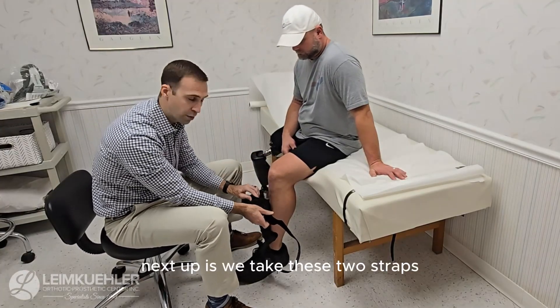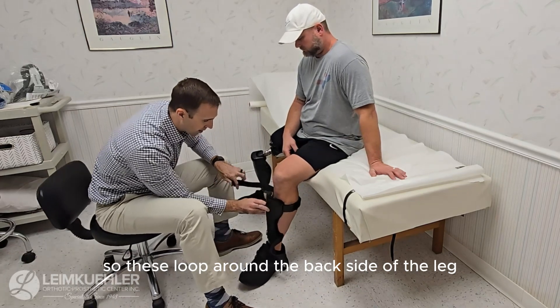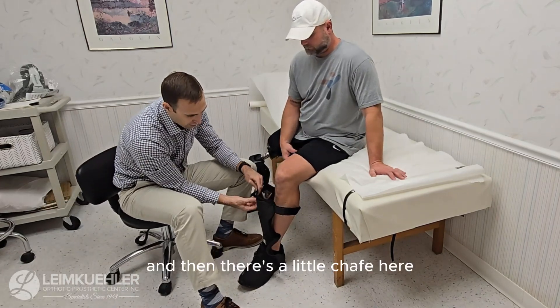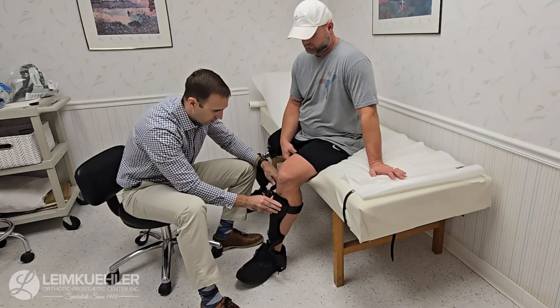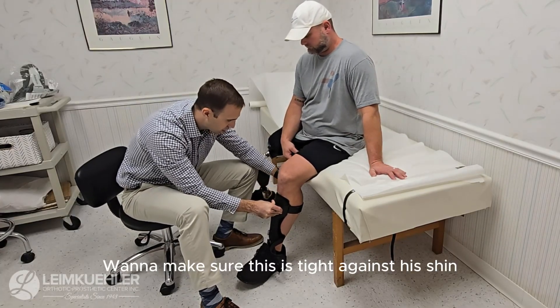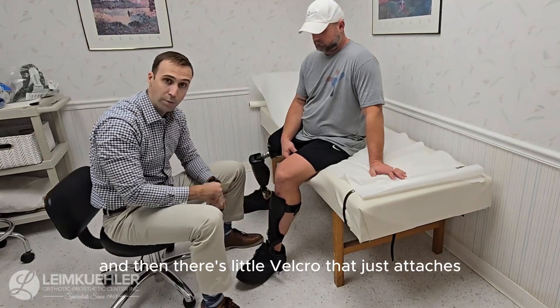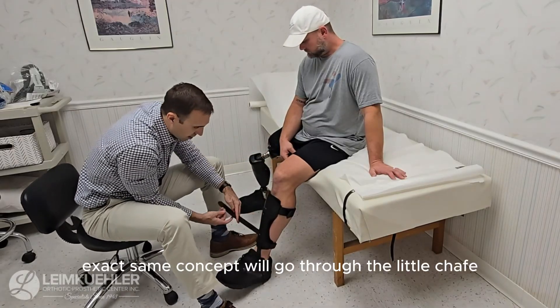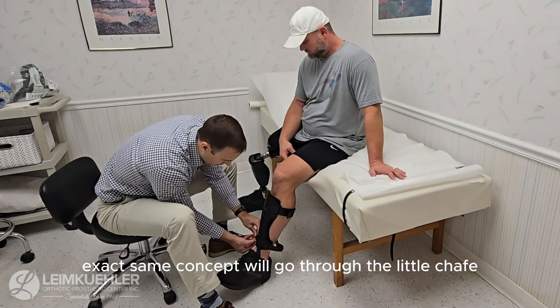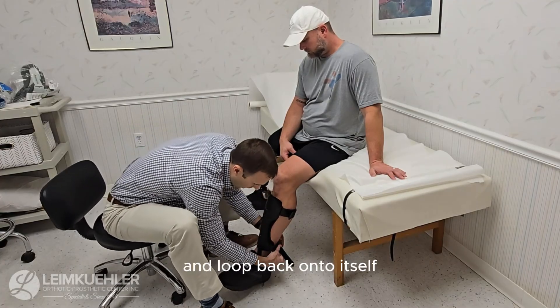Next step is we take these two straps. They loop around the back side of the leg and then there's a little chafe here, so this just loops through. You want to make sure this is tight against the shin, and then there's a little velcro that just attaches the brace. Second strap, exact same concept — go through the little chafe and loop back onto itself.